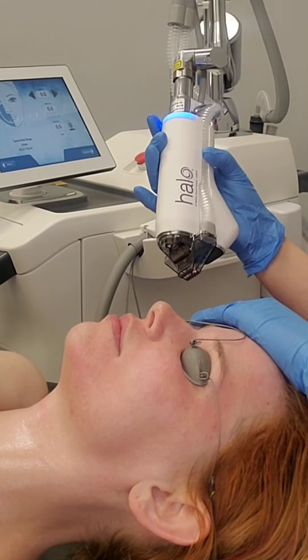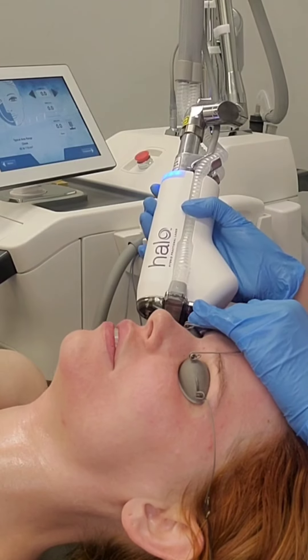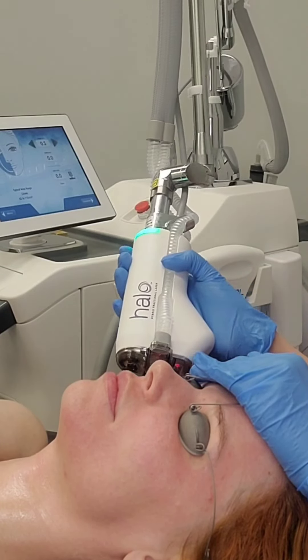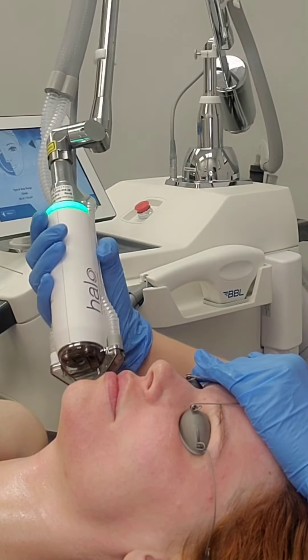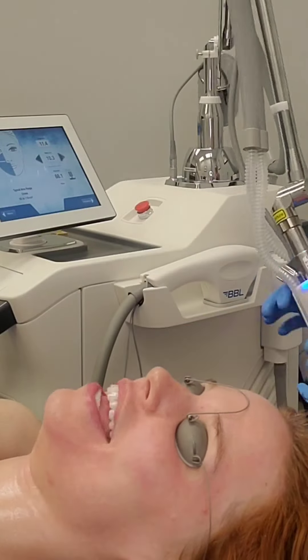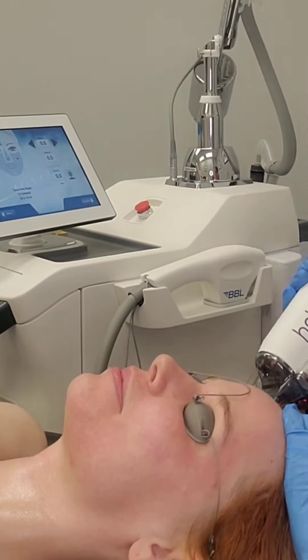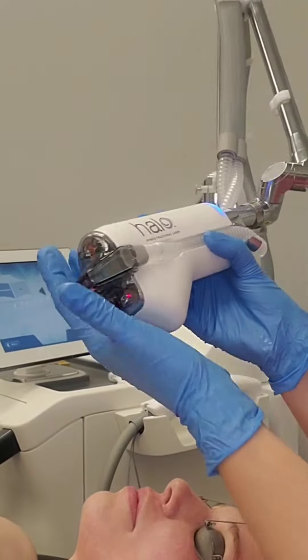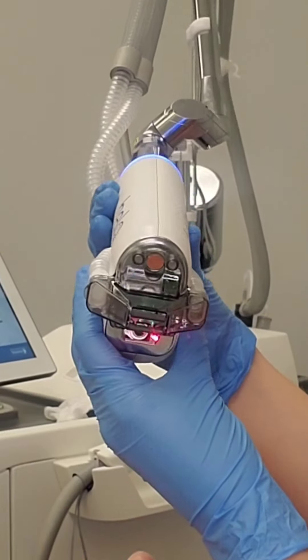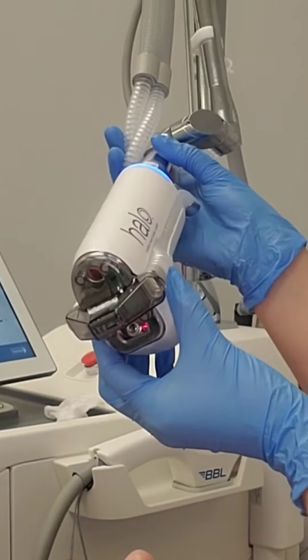I am not firing the laser at all right now — I'm just measuring your skin. What I'm doing here is measuring her face. The Halo laser measures anywhere that you're treating to make sure you get the proper density that you are trying to achieve. It's really good at making this dummy-proof. I think it's fantastic.